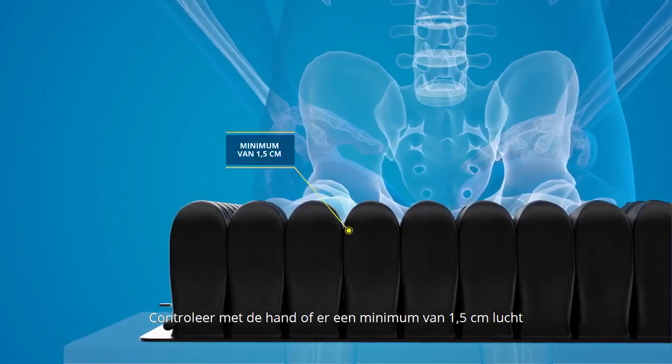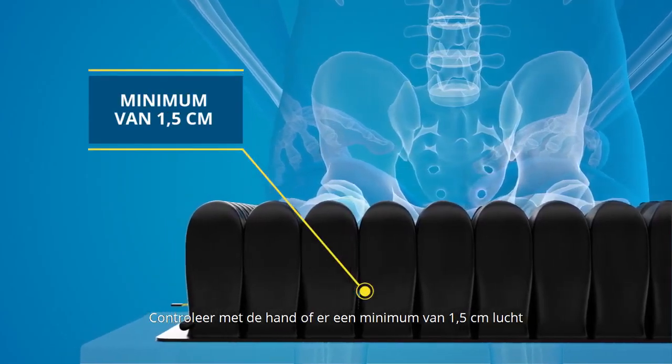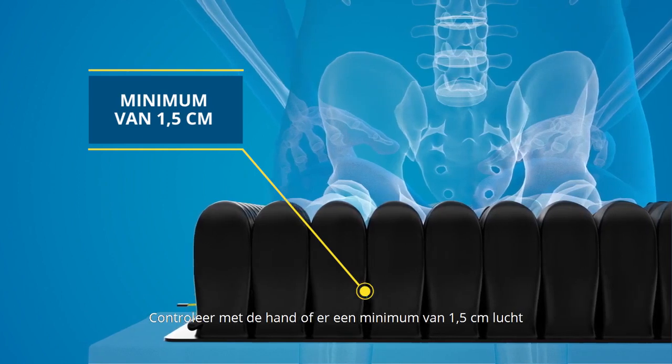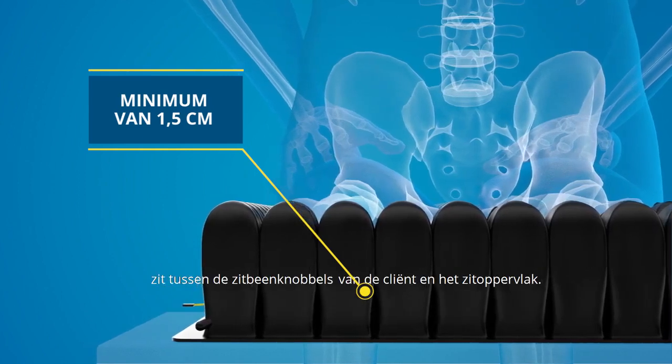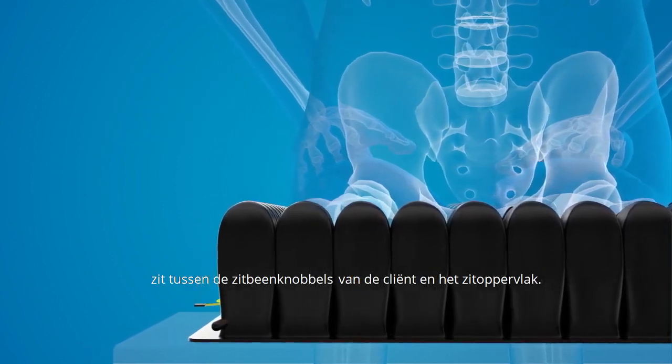Perform a hand check to ensure there is a minimum of one-half inch of air between the client's ischial tuberosities and the seat surface.